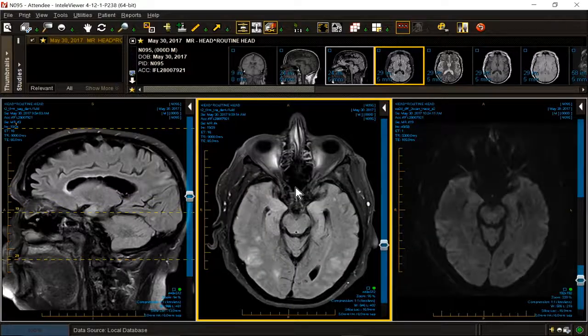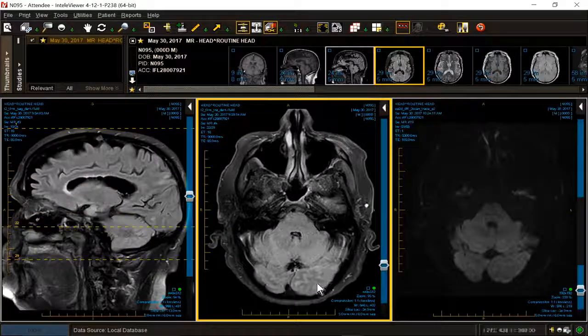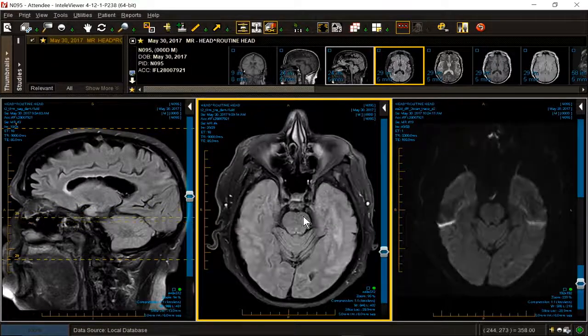Now, there are disorders that are thromboembolic that can involve the parieto-occipital region, like the artery of Percheron or the top of the basilar syndrome with the basilar aneurysm. But they stay closer to home, around the brainstem and the thalamus.